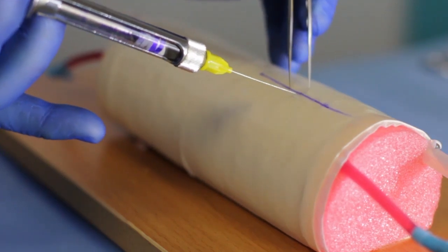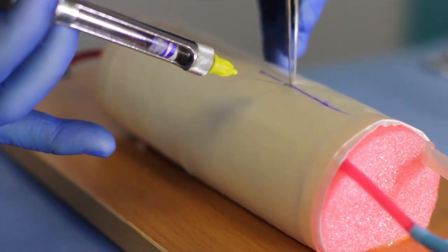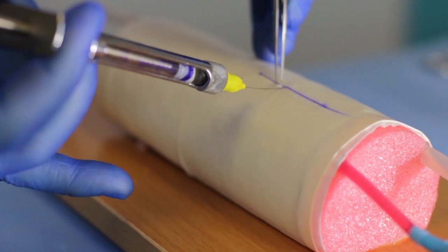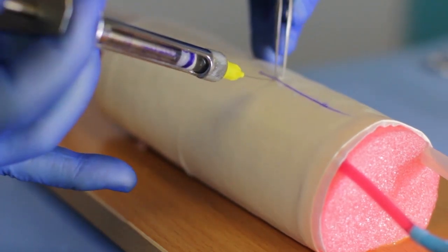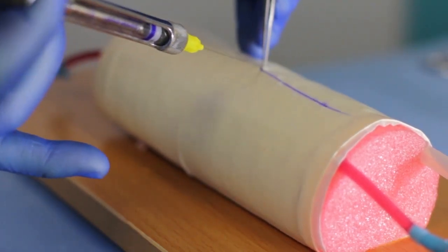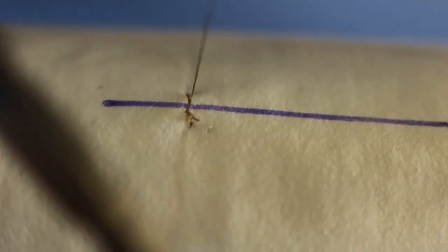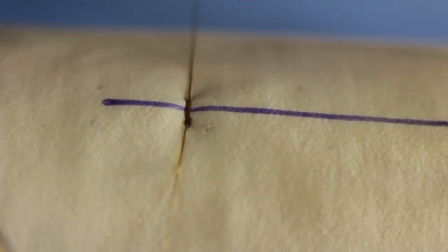Repeat the same process of injecting local anesthetic solution through the raw edge of the wound every plus or minus seven millimeters, or every one quarter of an inch, on both sides of the wound. Wait two to three minutes and start the suturing procedure.